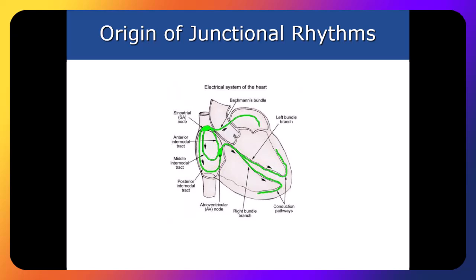Now, again, the intrinsic pacing rate of the atria is what? 60 to 100. Now we're coming down to the junction, the AV junction, the AV node, or you may just call them junctional. Under normal circumstances, what is the intrinsic pacing rate of the junction? 40 to 60. That's going to be one of the key things you look at when you're going through this 5-step process of identifying these rhythms, and that's really important.